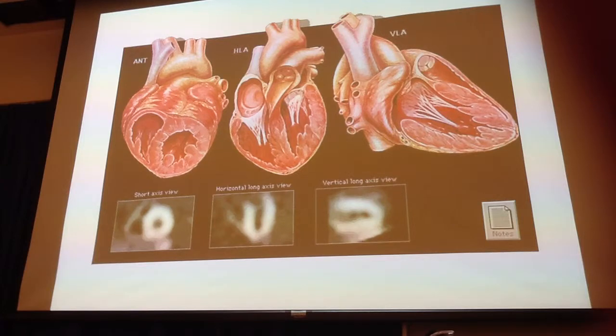There's a law that talks about the percentage of blood going to an area of the heart that is removed from the blood, and so we can actually quantitate the amount of perfusion, but it doesn't tell you if the myocardium is alive or not. So in that situation, what other radiopharmaceuticals could you use?